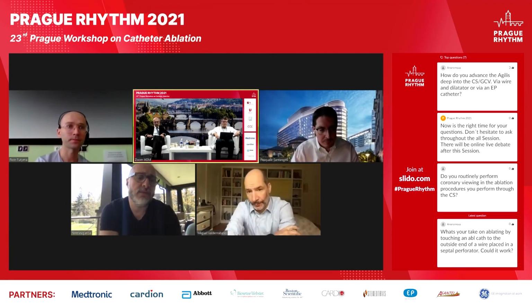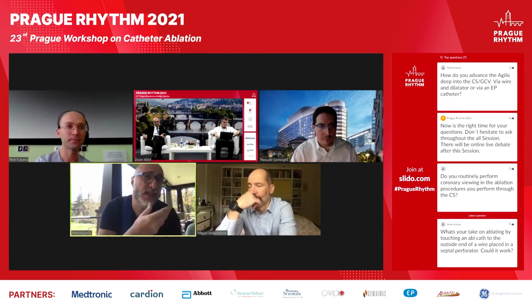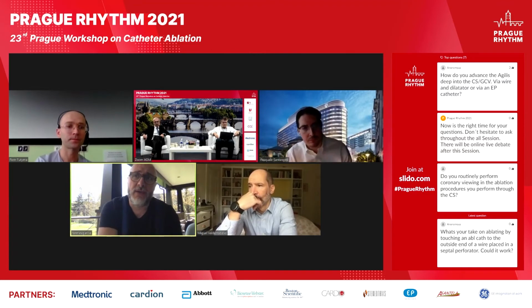Okay, there's another question for you. Is there any experience of burning intramurally through the mapping wire? Yeah, I personally do not have experience with the wires we use. It didn't work because they're not good enough. I know that there is a published case from Romero and UCLA that they used one of these wires to cross chronic total occlusions. But with these bipolar catheters and with the wires that we have, there's not been experience yet.